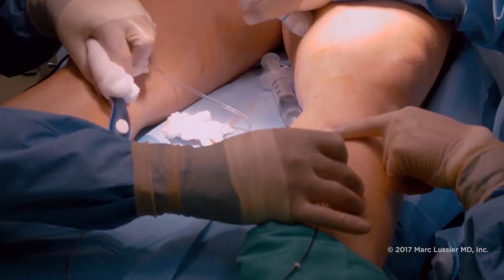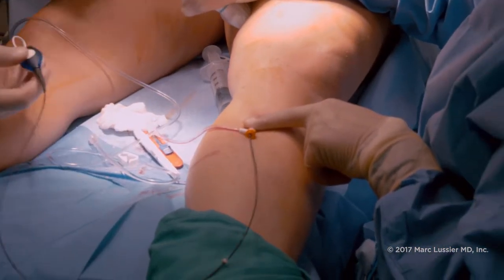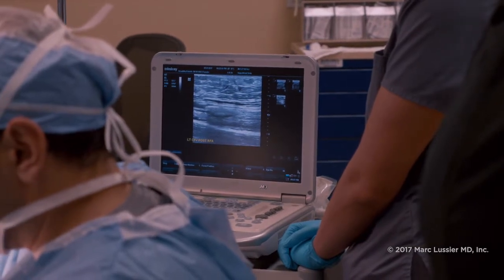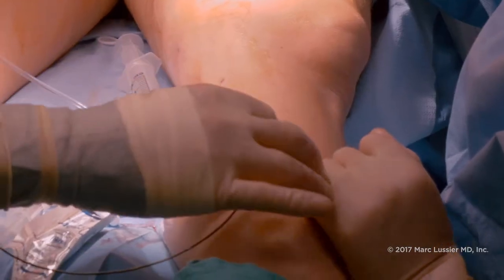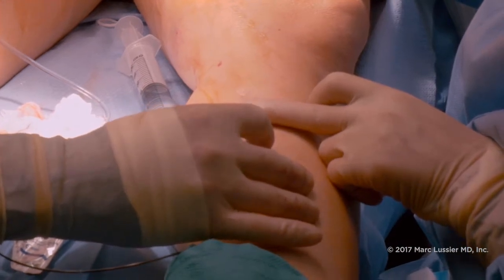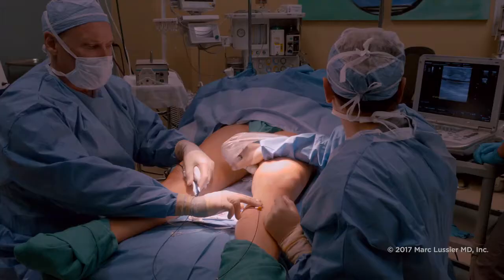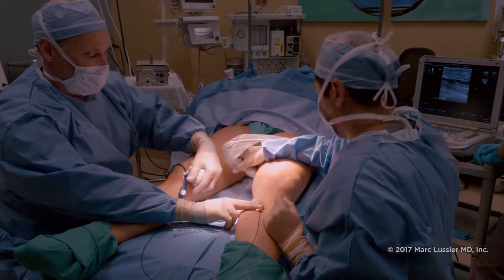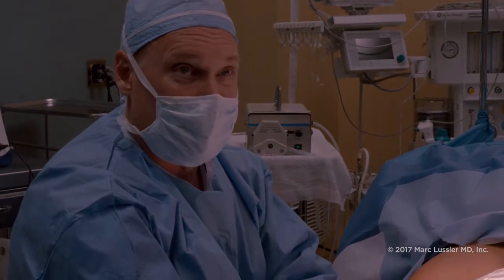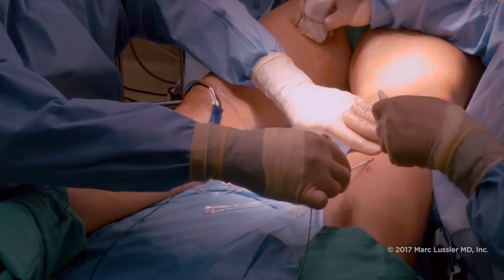Now we're going to pull back the catheter a little bit. This will be a third treatment. We're getting to the end of the catheter and finishing this part of the treatments. Following this cycle, we'll start pulling the sheath out and complete our treatment of the greater saphenous vein.